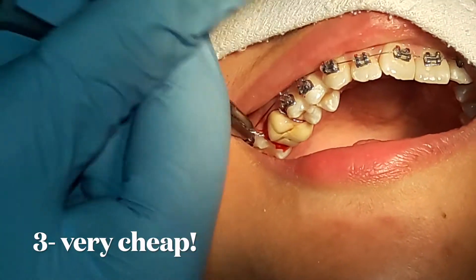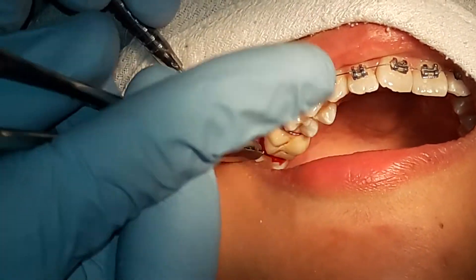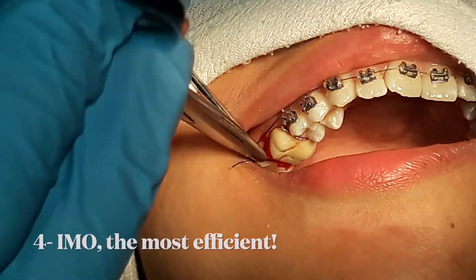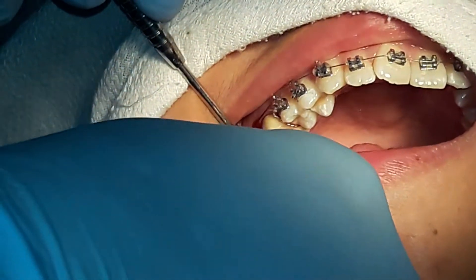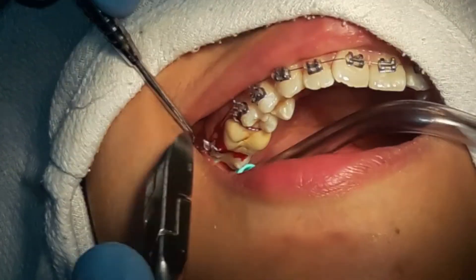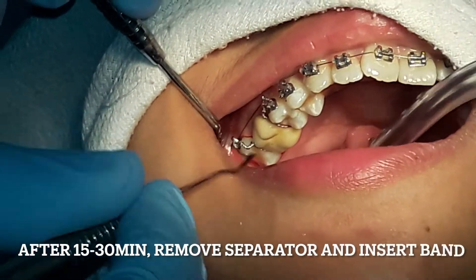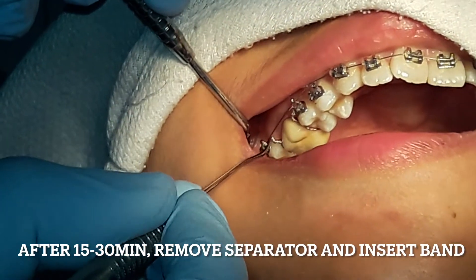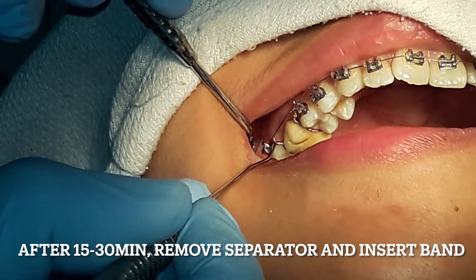Number three, it's very cheap. And number four, it is the most efficient way of separating teeth after brass ligature wire. The one thing I like about this technique is that after 15-30 minutes, you can remove the separators and then insert the band.